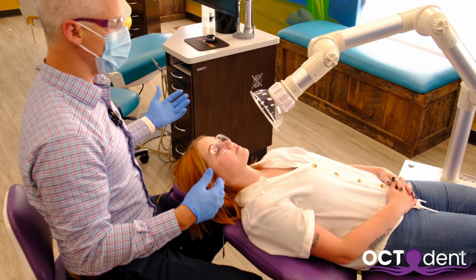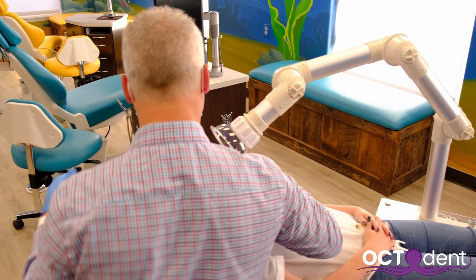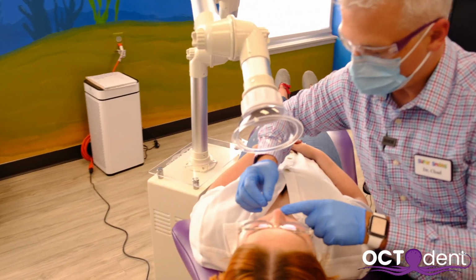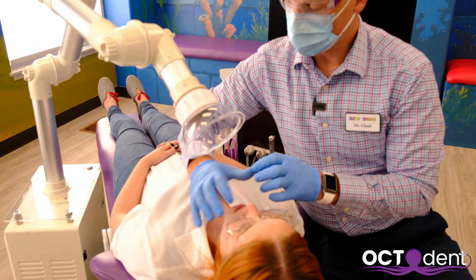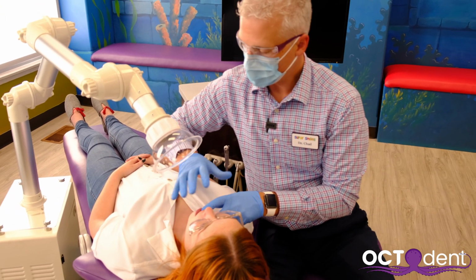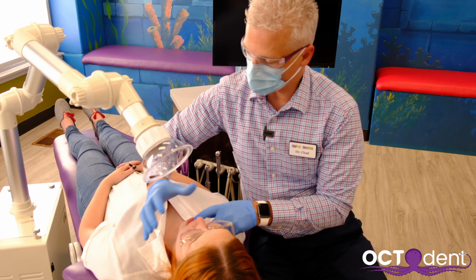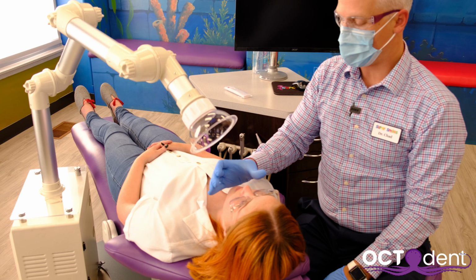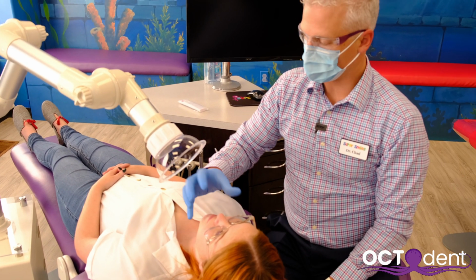Now, the only time that it really gets in my way is if I'm trying to come around like this and I'm working this way. But if you notice, I still have plenty of room to move my hands in this position because I can move around the patient's face. But as you can see, this is directly in front, and all of the aerosols will get pulled up into the unit right here.